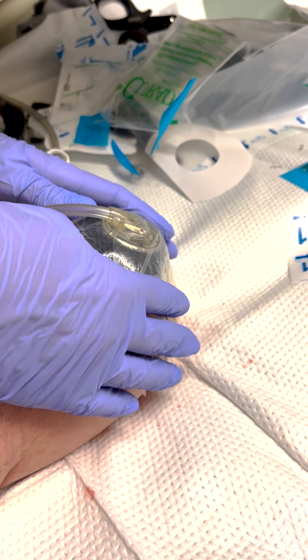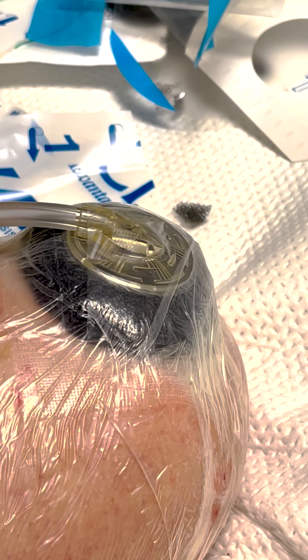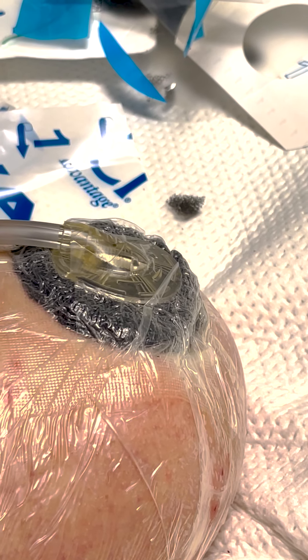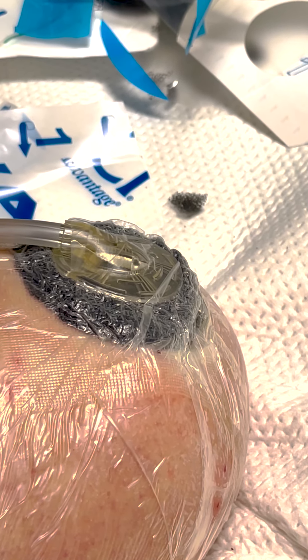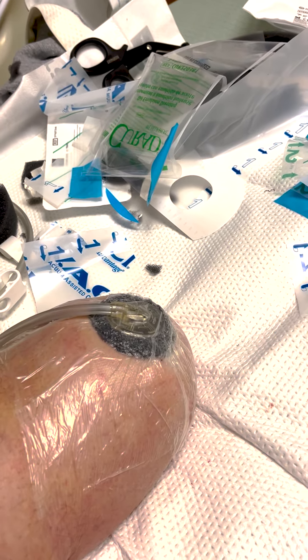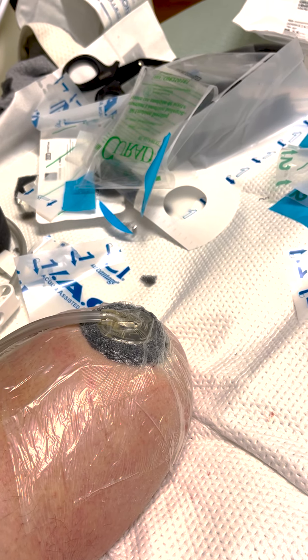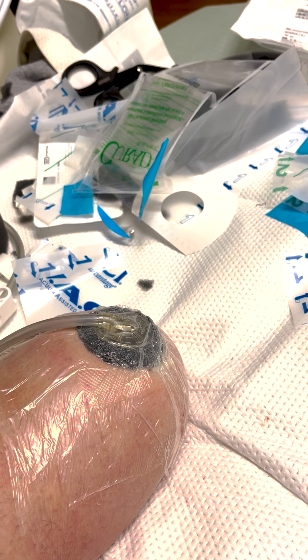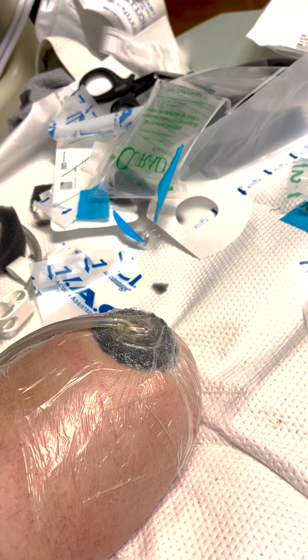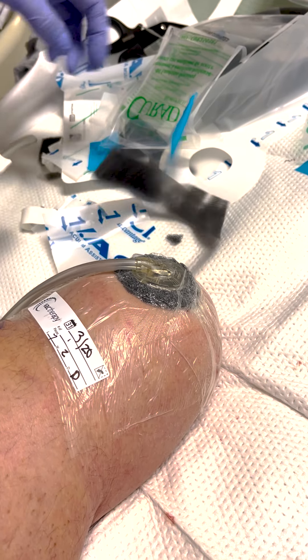All right, so now I'm going to turn it on. I feel like we might have some pieces we have to patch up a little bit, but I'm just going to turn it on. There it goes — look at that, beautiful. Kyla's writing out what to put on the sticker, and there's the mess that's left over. This is always my least favorite part, having to clean up the mess when I do the wound vac change at home, because without fingers it's really tough to pick all that stuff up. But there we go — everything's good.